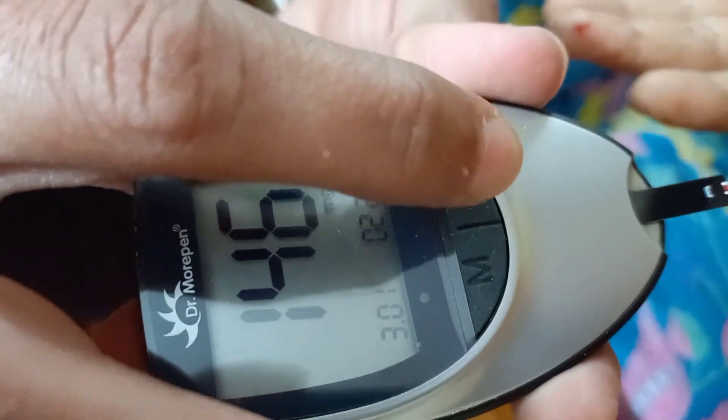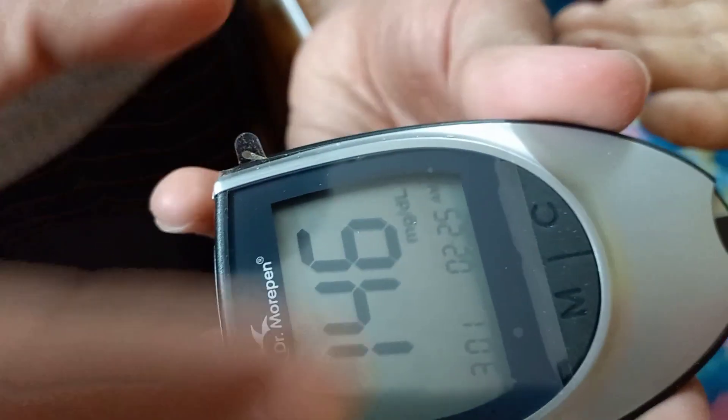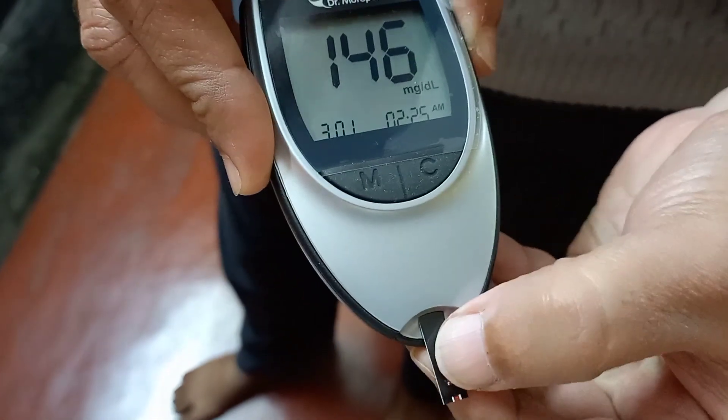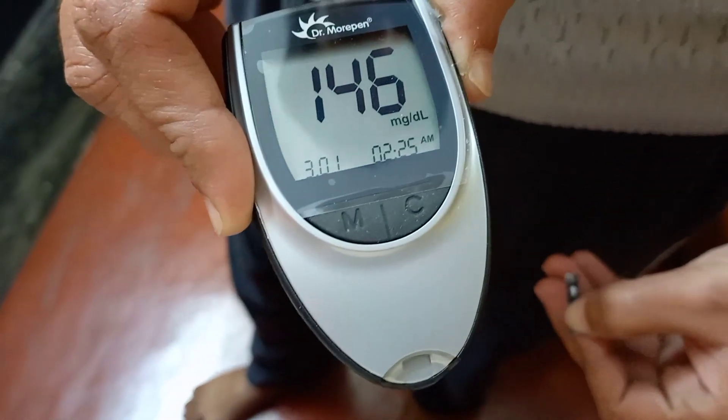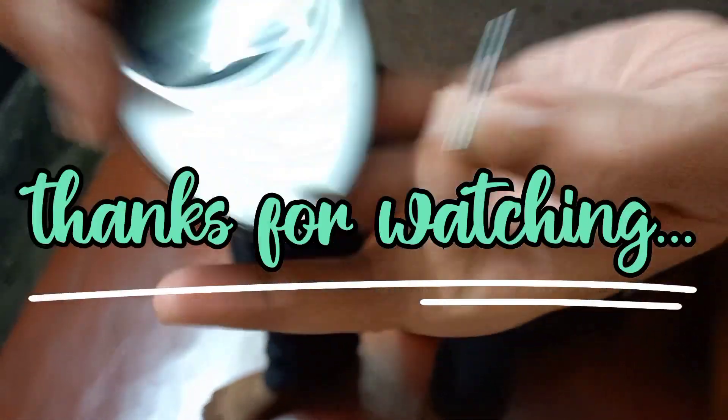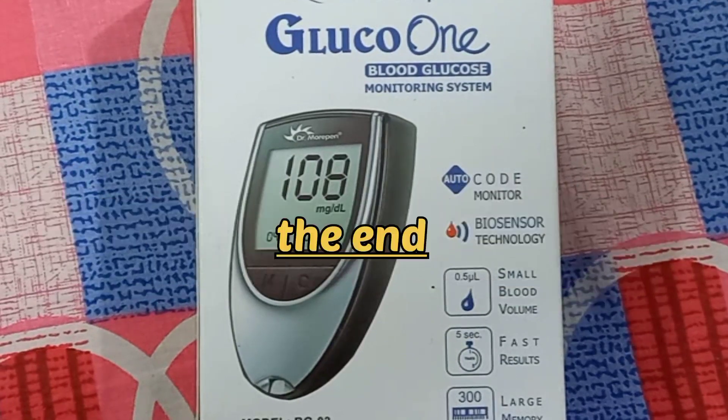It is very easy to use. After completion of the operation, take out the strip and the monitor will turn off. Thank you.